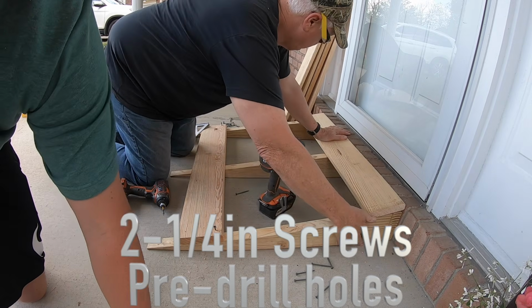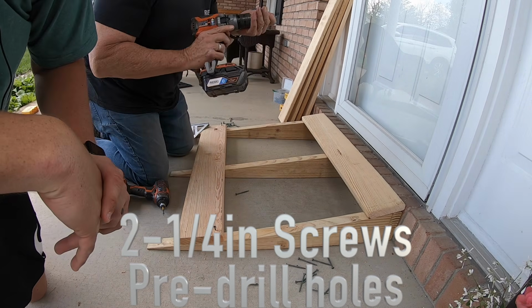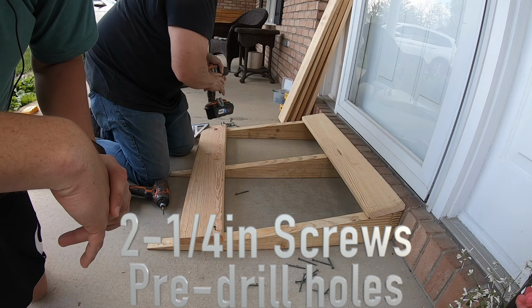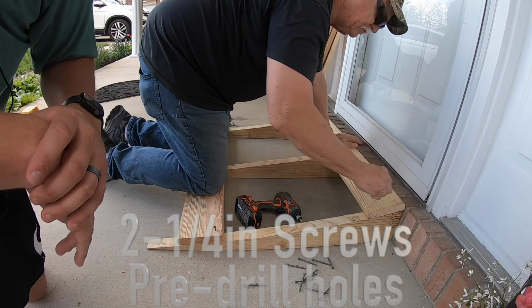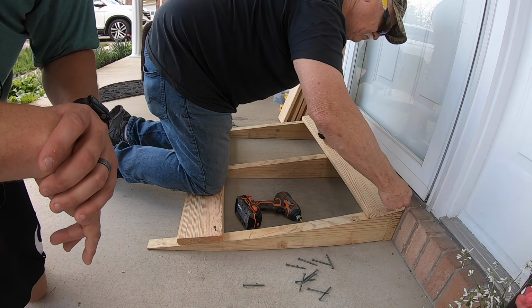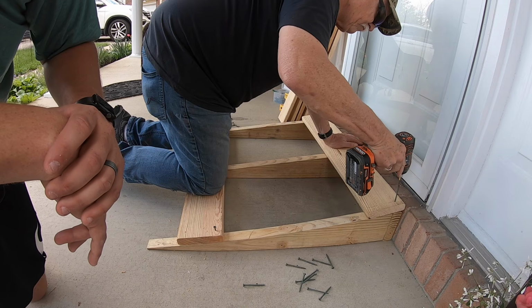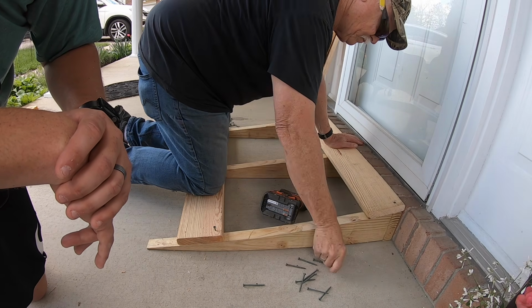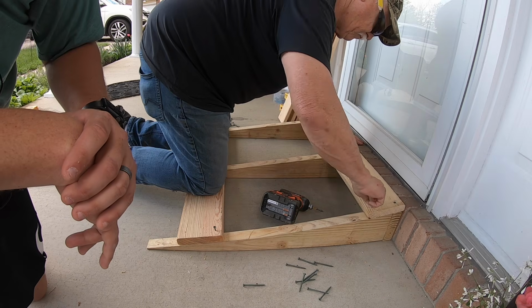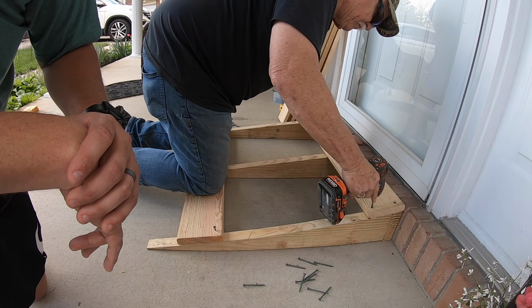And these are 2 1/4 inch screws. Remember, the 6 that we used in the back were 3-inch screws. We may have to use a couple of smaller ones down here, but at least for the majority of it, we will use 2 1/4 inch screws to really make sure we're down and in there well. And you're just going to repeat this whole process with each and every one of them, the pre-drill, and 6 screws per planking board.